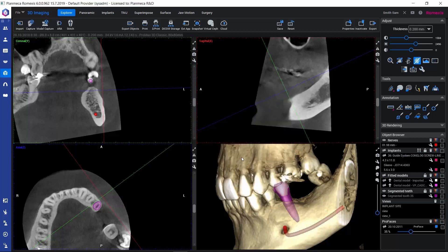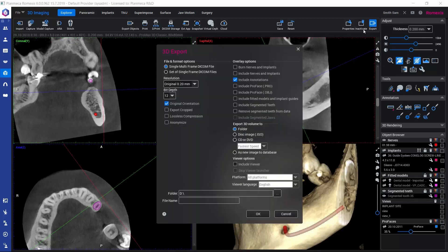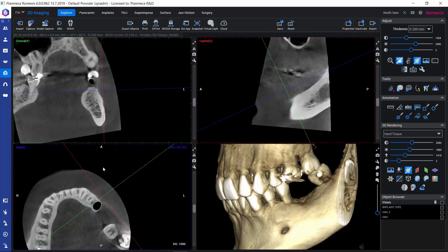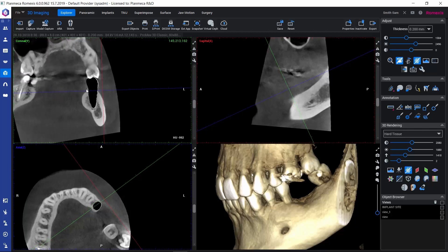Another option is to export the segmented teeth together with the volume using the normal volume export. Here we have the option of including segmented teeth, and by selecting this, we can export them together with the volume — they will also be exported as separate STL files alongside the DICOM volume file. There is also an option for removing segmented teeth from the data, which creates a new volume where the tooth is missing from the data.